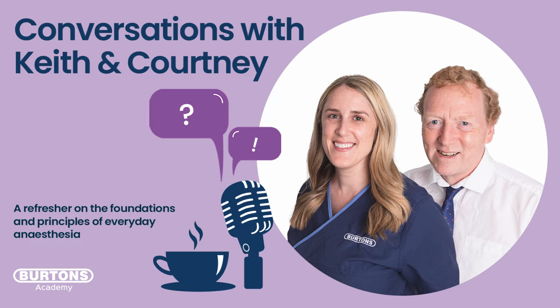So Keith, I know this is one of your favourite topics, and I know that you have a few bugbears around lingo. So why should we really care about CO2 levels in the body? Why are we not just getting rid of CO2? Yeah, I think to answer that question, you have to go back a few steps from where you just started. You just gave some examples of end-tidal values of CO2 in our exhaled breath. Over a certain limit is hypercapnia, and below a certain limit, hypocapnia. So we're starting at the end there. That's where breath is expelled from the body.